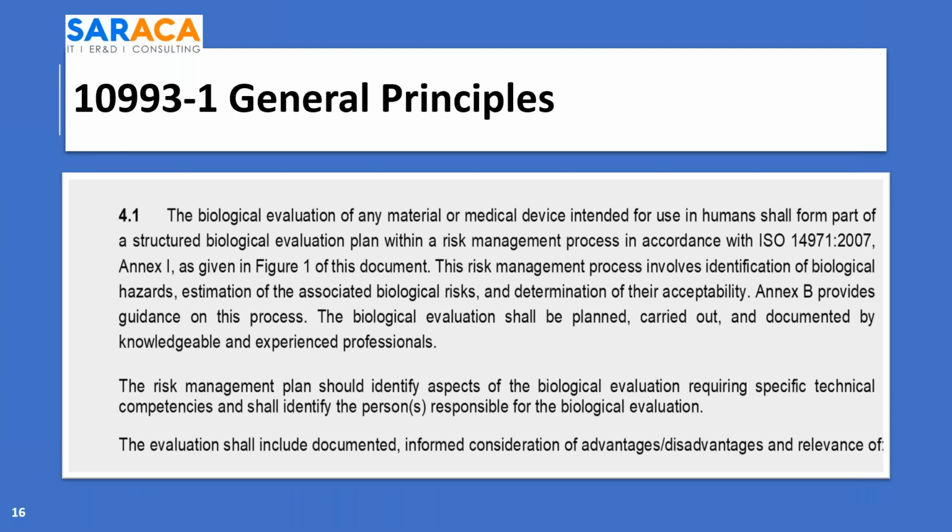General principles: the biological evaluation of any material or medical device intended for use in humans shall form part of a structured biological evaluation plan within a risk management process. The risk management plan should identify aspects of biological evaluation requiring specific technical competencies and shall identify the persons responsible for the biological evaluation, and it should contain their CV as a method of demonstrating competence in the area.